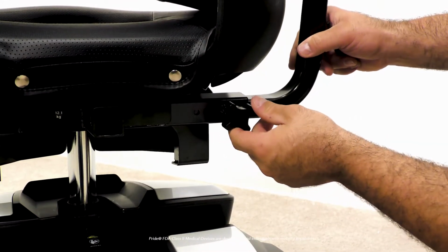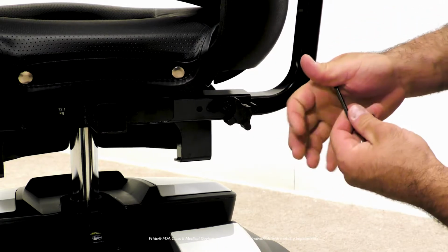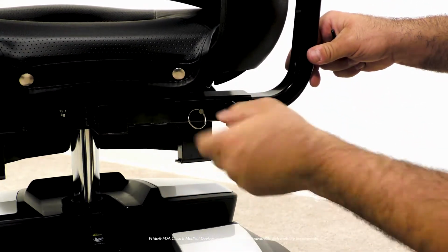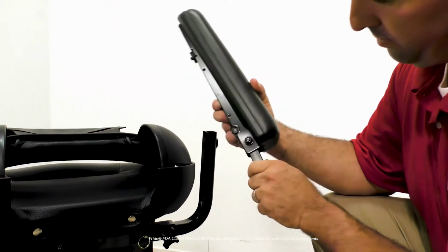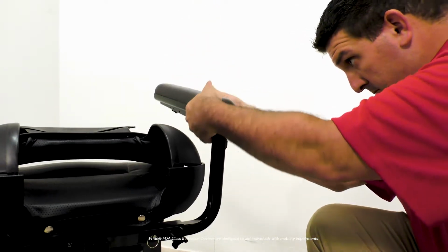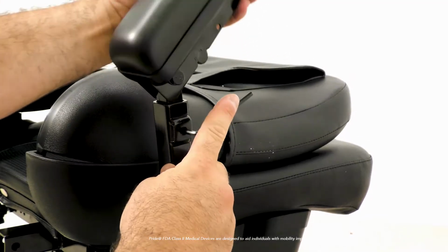Slide the lower half of the armrest in the receiver and set to the desired width by aligning the holes. Use the smaller detent pins and adjustment knobs to tighten. Make sure the nut is on the inside of the armrest. Place the upper half of the armrest in the lower half and tighten the set screw once the desired height is reached, and repeat on the other side.